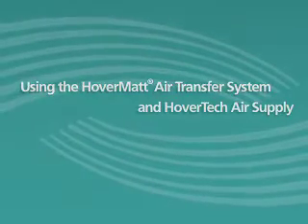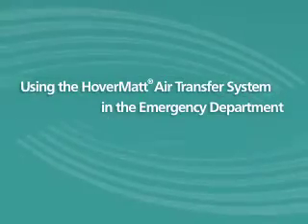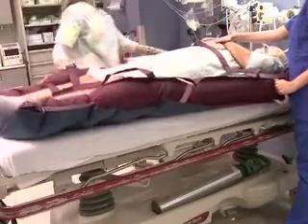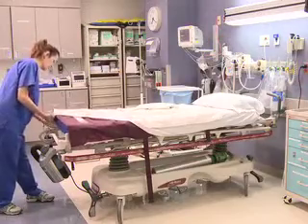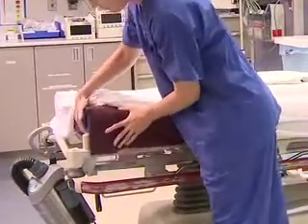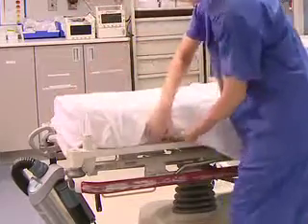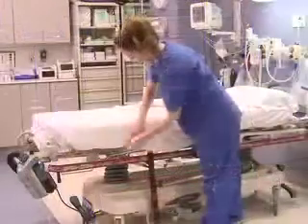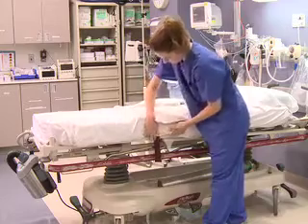The emergency department, as a major patient entry point to the hospital, will often be the first area in the hospital where HoverMatt use is initiated. ED stretchers should be equipped with HoverMatts in anticipation of the emergency patient's arrival. Whatever linens are placed on the bed mattress to keep it clean can be placed on top of the HoverMatt to keep it clean. Tuck the top linen in under the stretcher mattress. Ensure that the patient's safety straps are out of the way, yet still visible.